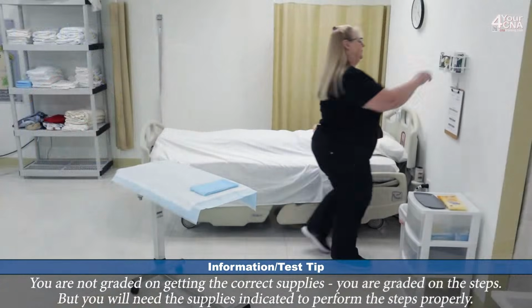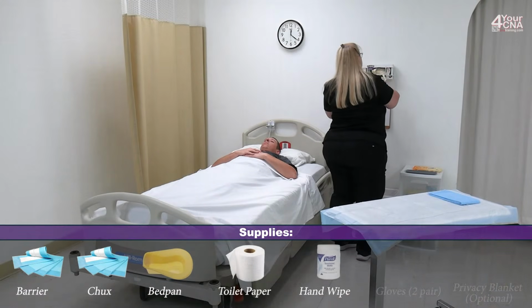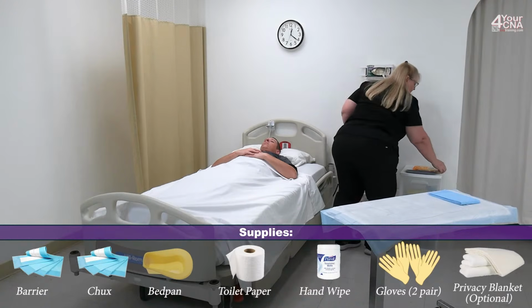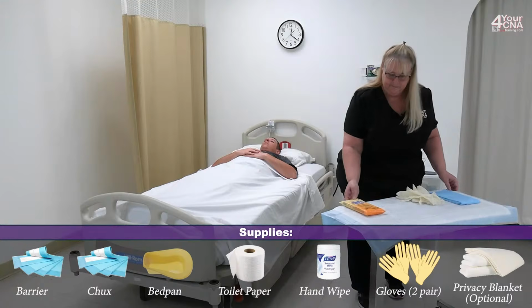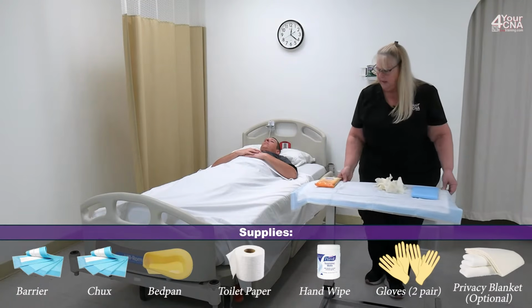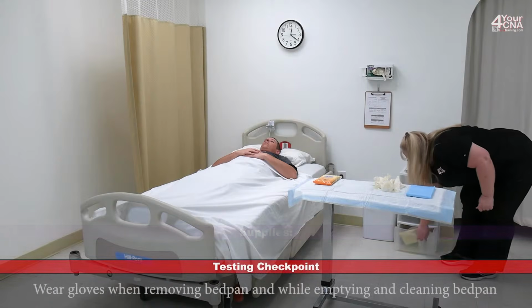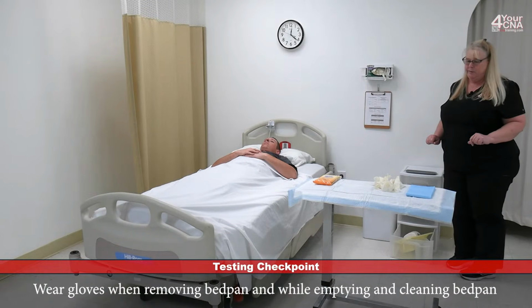I need a set of gloves, a second set of gloves, hand wipes, and I'll need the bedpan, which will be in the bottom drawer. I'm going to open the drawer, but I'm not going to touch the bedpan until I put my gloves on.